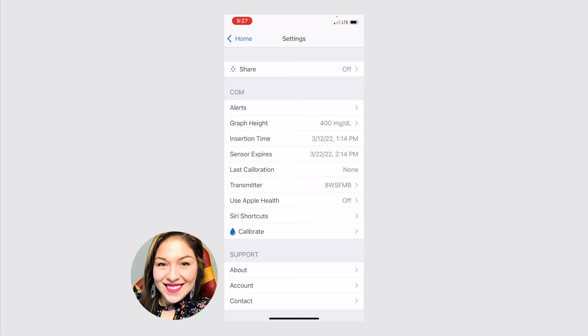This is really important information to know because, say, for example, you're going off on vacation for a few days, this will help you know, do I need to pack another sensor with me? Will my sensor end while I'm away from home while I'm away from a pharmacy? So that way you can plan ahead and make sure that you're ready for changing your sensor if you need to.